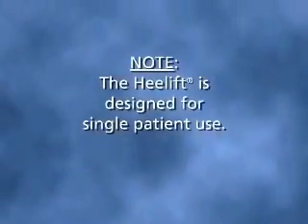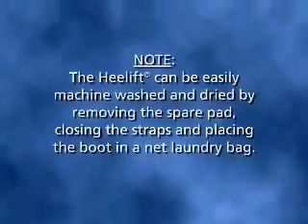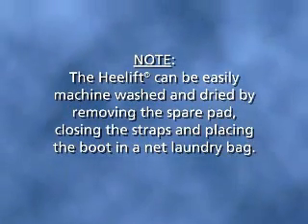Note: the Heelift is designed for single patient use. It can be easily machine washed and dried by removing the spare pad, closing the straps, and placing the boot in a net laundry bag.